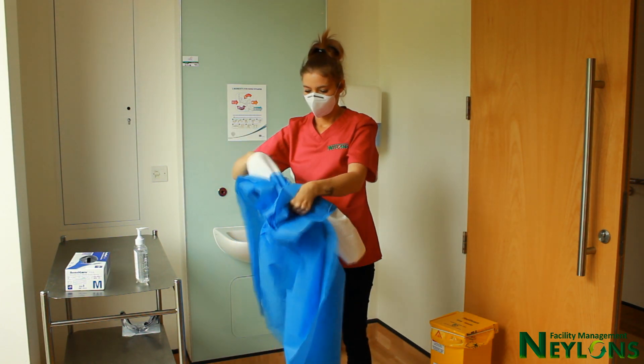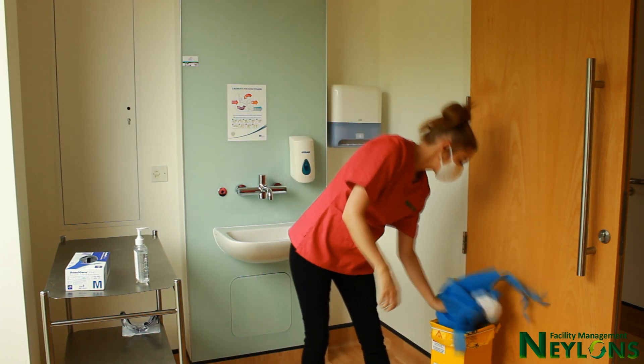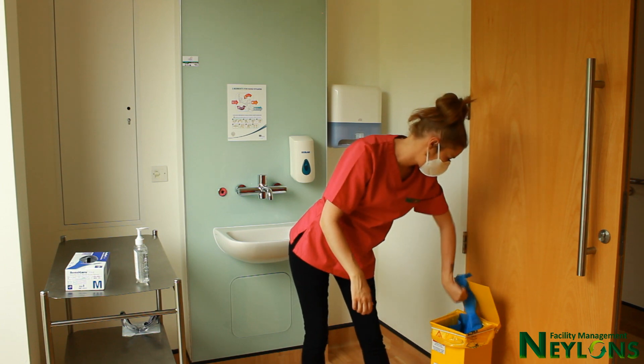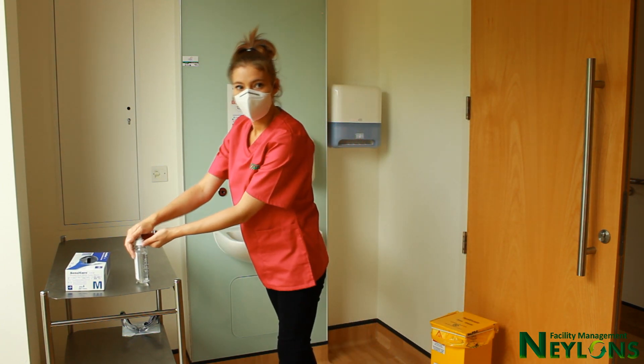Fold the contaminated front away from your body and do not touch the front at any point. If there is no ante-room available, leave your mask on until you leave the patient room and remove outside the room. If an ante-room is available, you can remove all PPE in the ante-room.